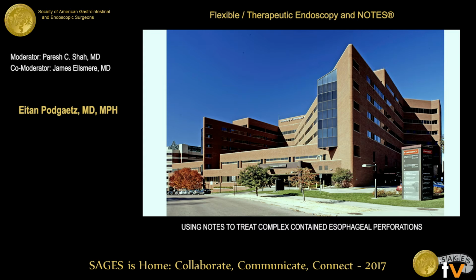Christy, I'd love to hear your thoughts. I mean, we haven't done a ton of these. We use the double J's a lot in the abdomen. That's great, and they seem to work great. I think for me, I wouldn't use it necessarily in the mediastinum unless the patient was pretty stable. You know, some of those ones that you described was like, get a big drain in there and get out and drain it, but the double J's can clog, and they're not as big as a big tube like you had.